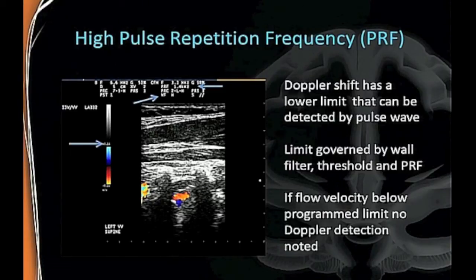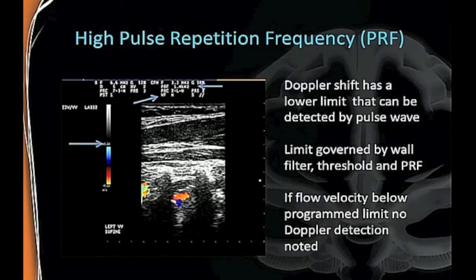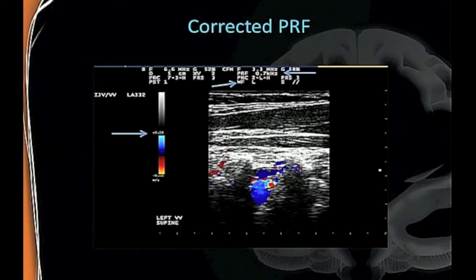Again, your PRF and settings matter greatly. Here's the vertebral artery, and here's the vertebral vein—there appears to be no flow. I've seen numerous cases where people say there's no flow and it's blocked, but if they would change their PRF, there's actually lots of flow there. It's just such slow flow in supine position that they haven't lowered the PRF enough to see it.